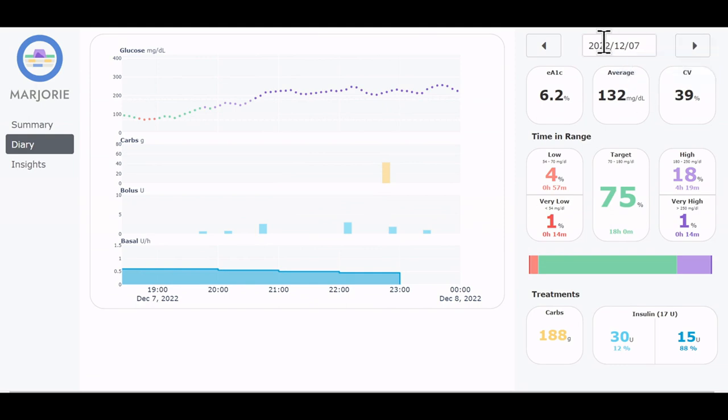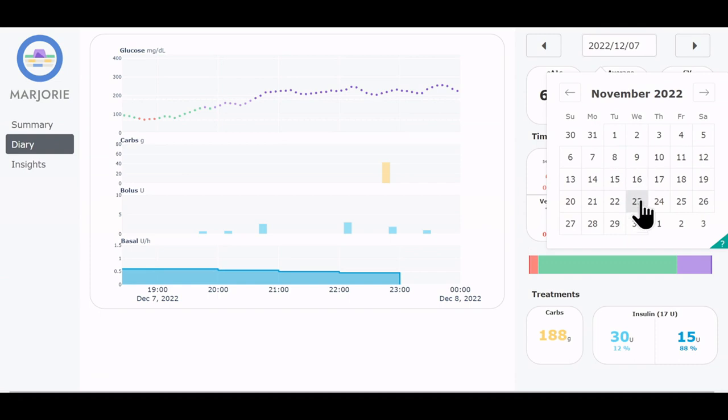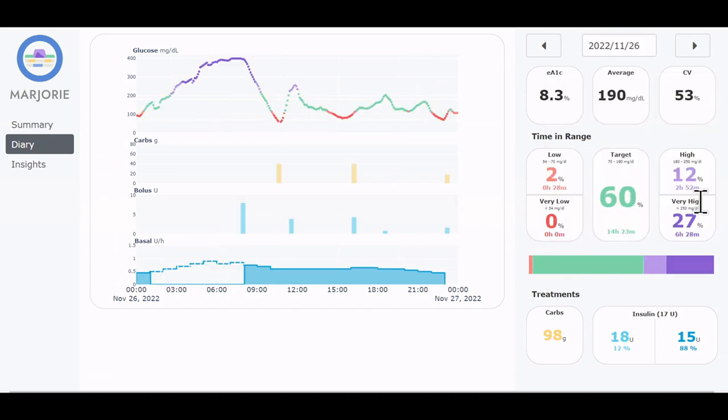Now we navigate to the 26th of November to observe the high glucose period that we discovered earlier. And we see that during the night, the basal rate delivery of the pump was interrupted, explaining the uncontrolled rise of values.